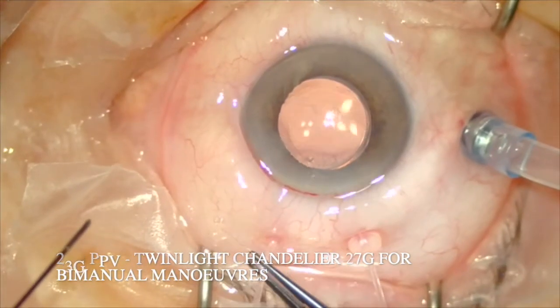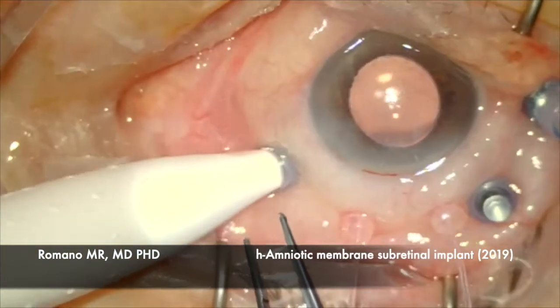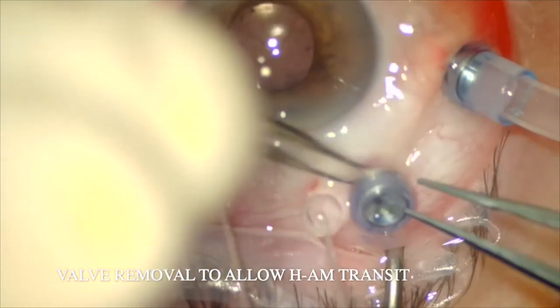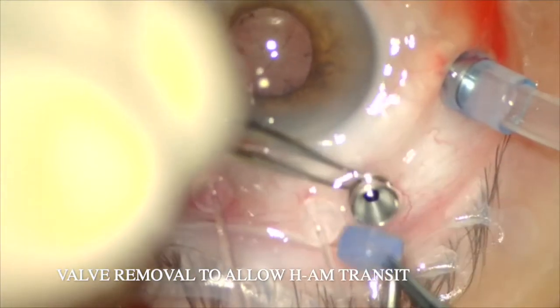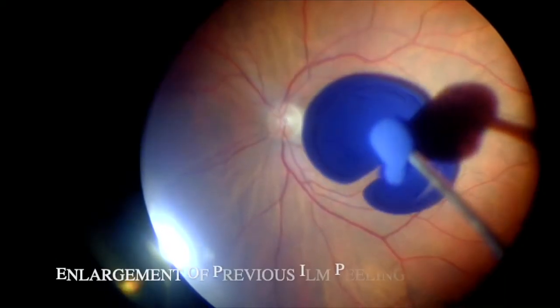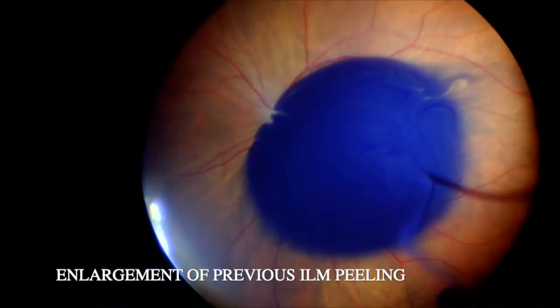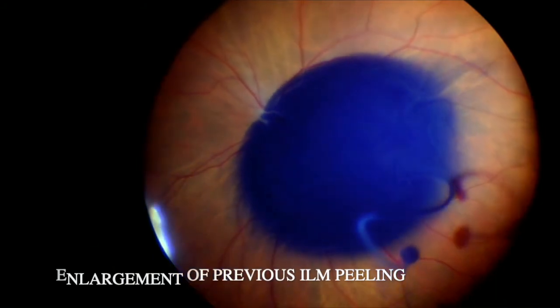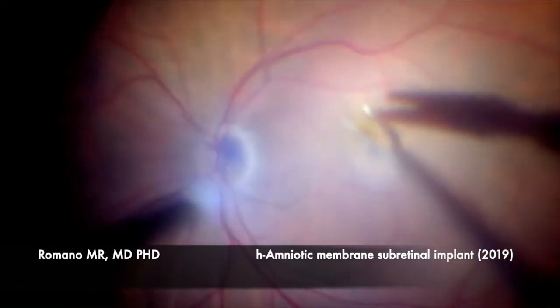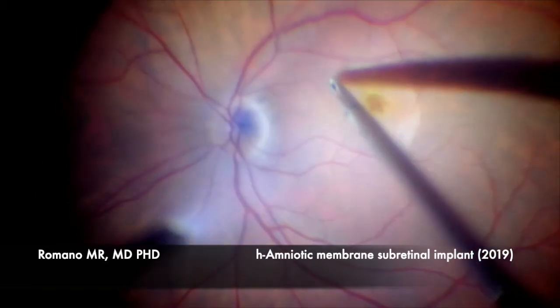We did first the cataract surgery and IOL implant, because in the previous surgery only the vitrectomy and ILM peeling were done. We are also using a 27 chandelier twin light in order to better maneuver the flap inside, and we are checking whether the ILM peeling was completely done in the previous surgery. As you can see here, I think we need to enlarge a bit.